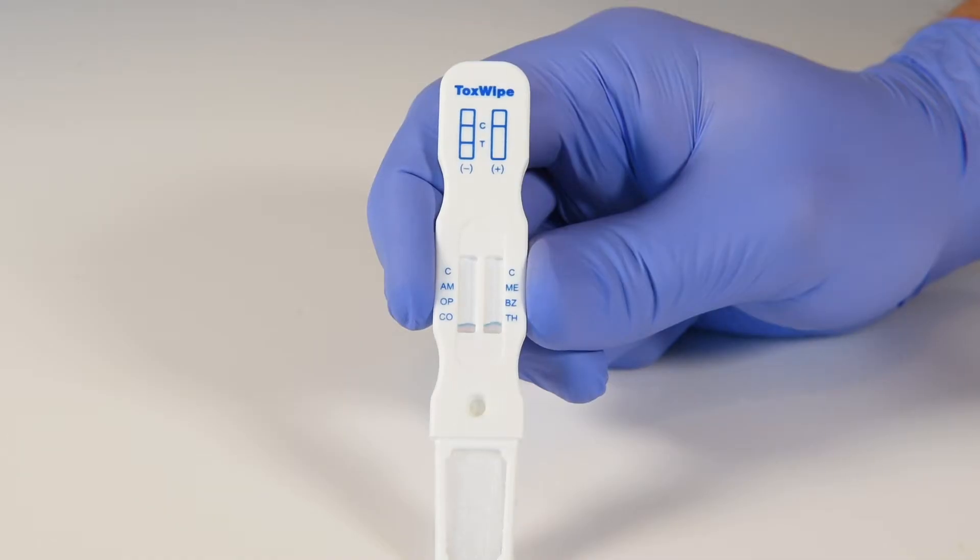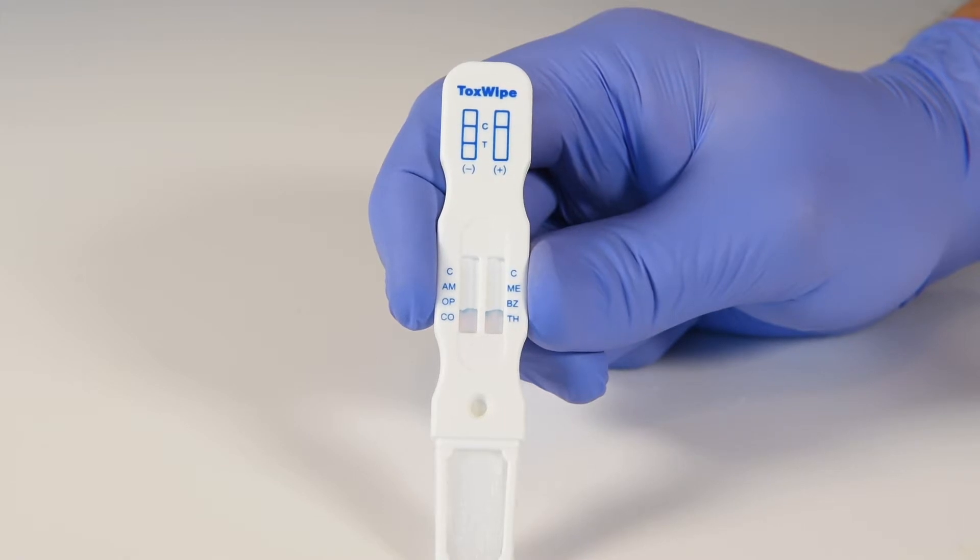Check the saliva sufficiency indicators as you collect saliva. Once they start wicking, you may insert the toxwipe into the buffer cavity.